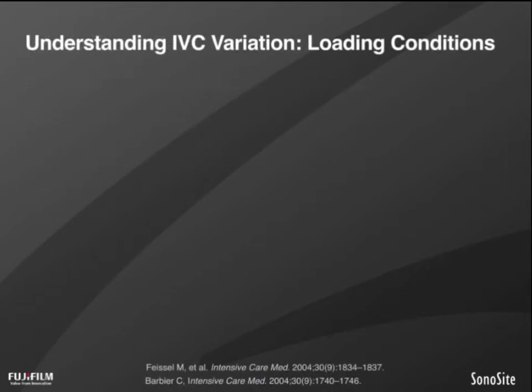So when talking about the inferior vena cava in the long axis, you have to understand the concept of loading conditions. How does the IVC change its size? Well, it changes its size based on respiratory pressures. The respiratory pressures and volumes that patients generate when they're spontaneously breathing vary from breath to breath. No two breaths are identical.